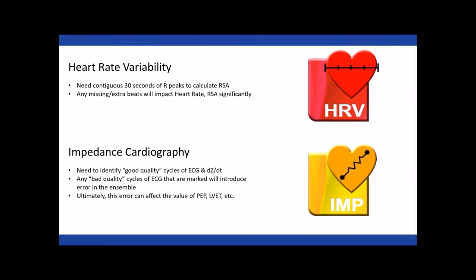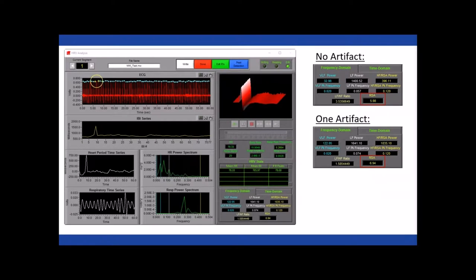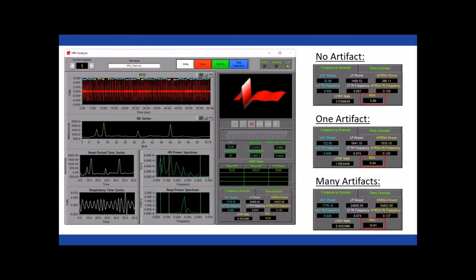With impedance cardiography, we're looking for good cycles of ECG and DZDT to form our ensemble or average cycle for that segment. If we have bad cycles marked, we'll corrupt that average and affect all of our statistics. As an example, with a clean segment, introducing even one artifact can change the RSA value by an entire unit — which is statistically significant. So it's really important to pay attention to artifacts and correct them using the ECG editor.